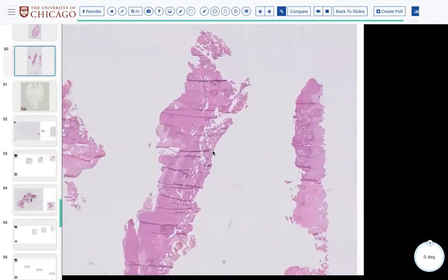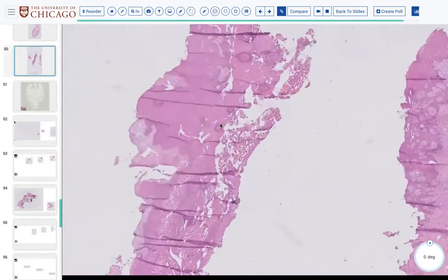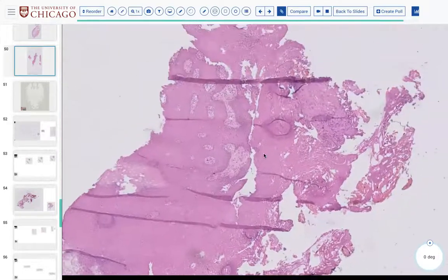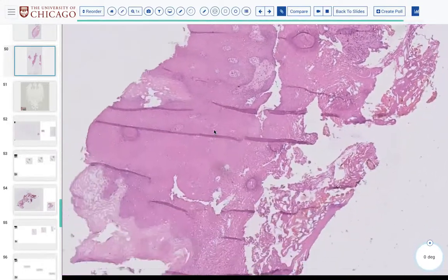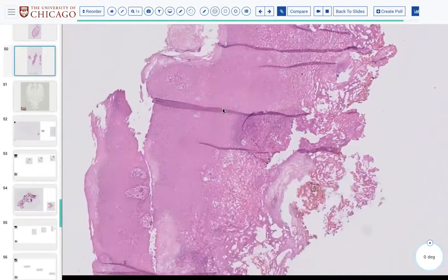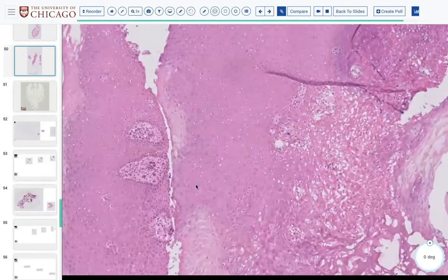Yeah. Especially something like this, that's actually mostly surface and not really any stromal interface. Like, I don't even know. You can't really tell what's up and what's down necessarily, because it's all just keratin, but focally.